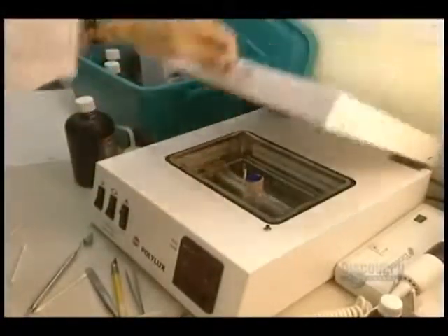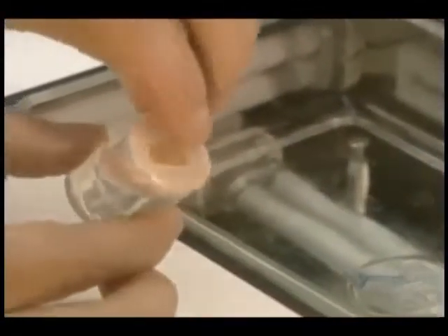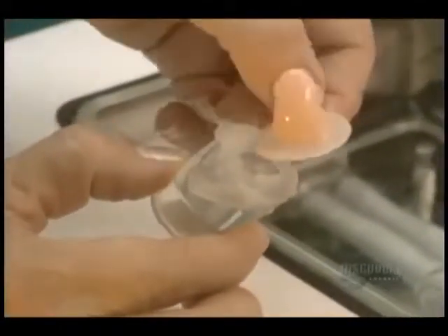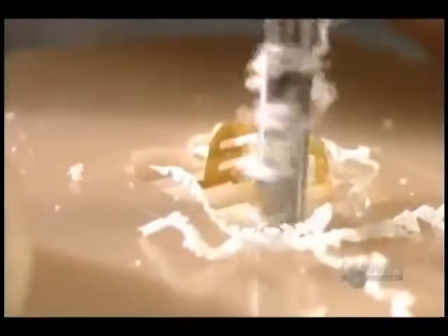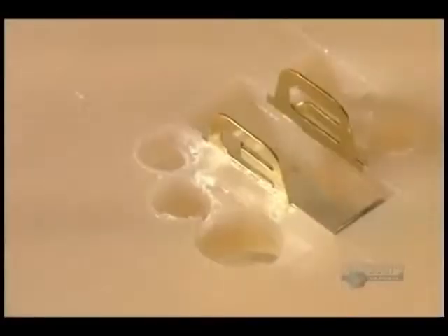The mold is placed into an ultraviolet oven which, without emitting any heat, hardens the acrylic. Here is the raw prosthesis without its electronic components. This plan details the electric circuit of the amplifier, and holes are pierced for the volume control.